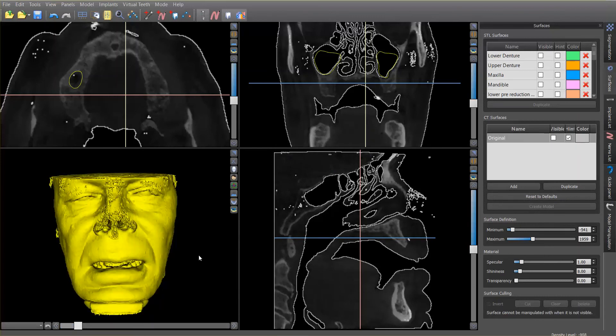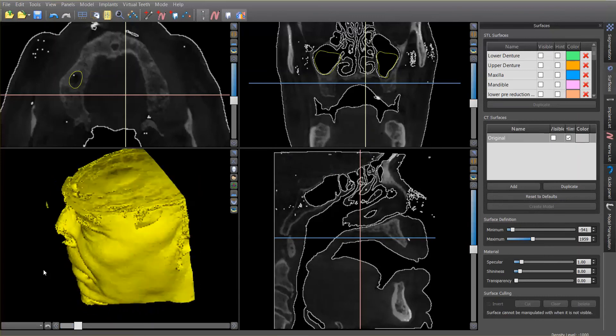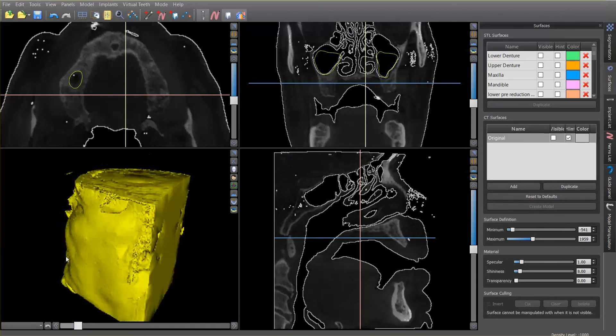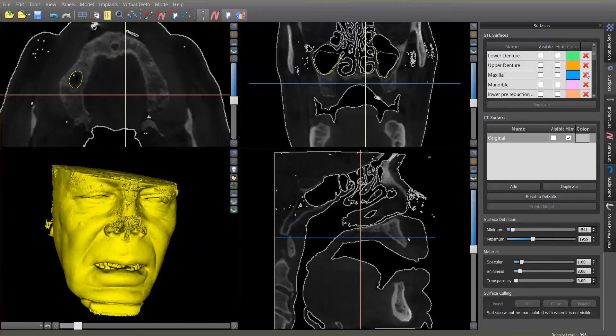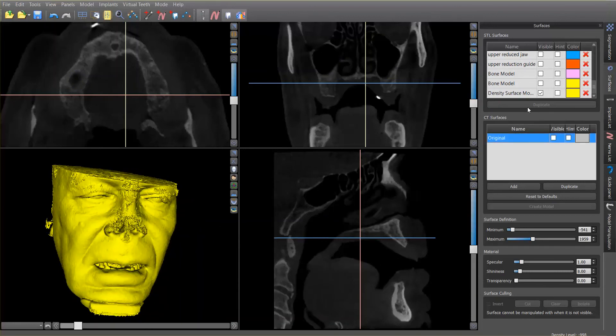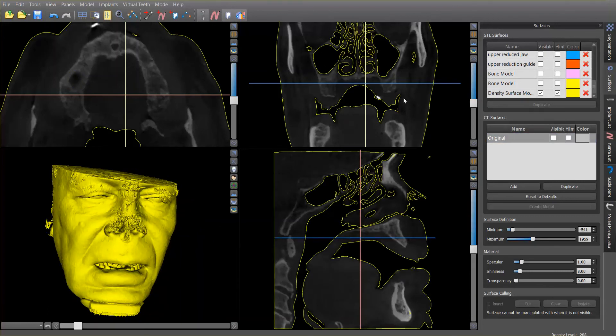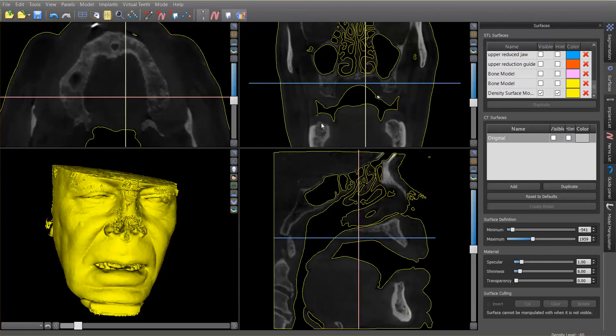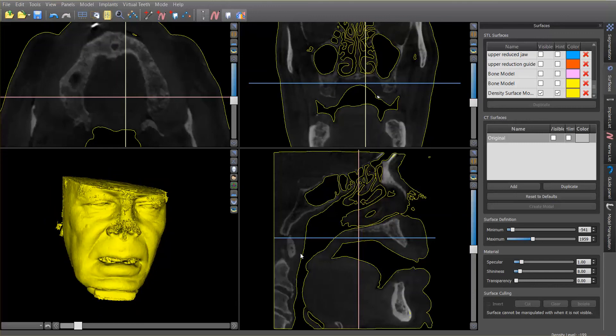Okay, so check this out. We've got an STL file now of this patient's face, but more important than that, what I was after, if I turn off that, is we can now turn off the hint on the CT scan, and let's turn on the STL outlines. So you can look, and within the skull here, all of these airways are perfectly outlined in this yellow line.